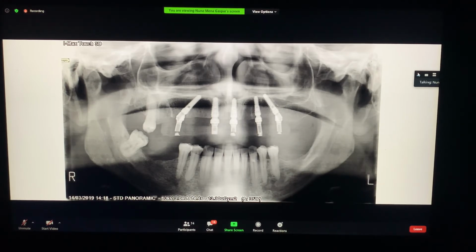Noble Active, as many other similar designs, because Noble Active came from a previous design, and now even other companies have the same design, calling it another thing. That kind of design is very aggressive to bone. It crushes bone. It may be useful to gain primary stability, but for sure, in some cases, it will cause bone problems. So that's why I prefer to use this kind of implant instead.